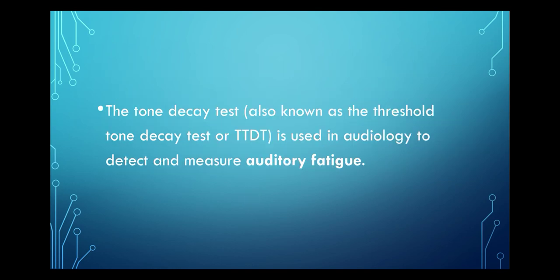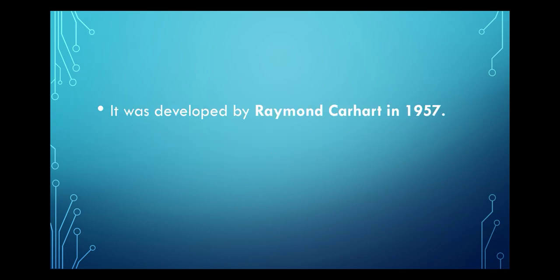The tone decay test, also called the threshold tone decay test, is used in audiology to detect and measure auditory fatigue. It was developed by Raymond Carhart in 1957.